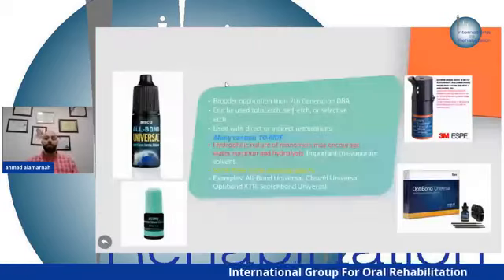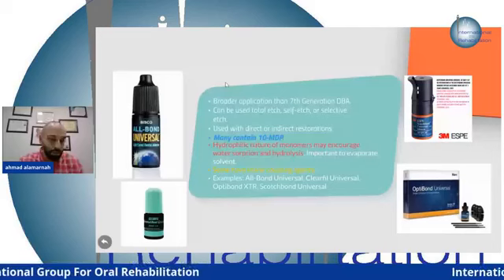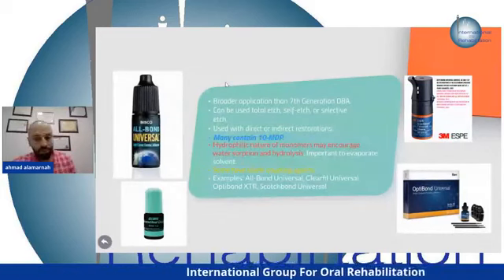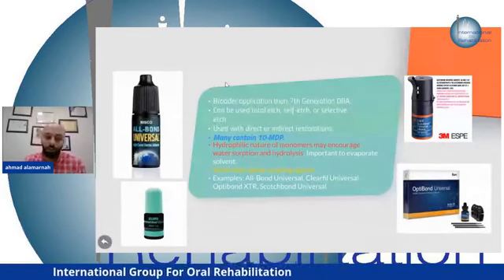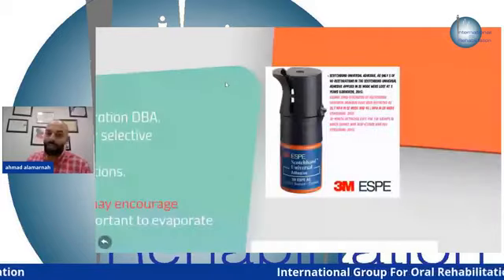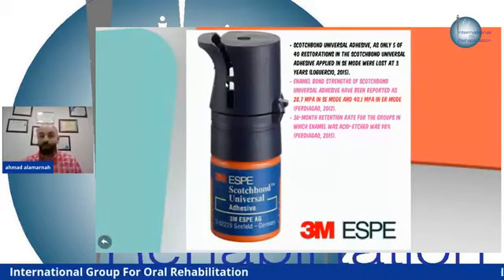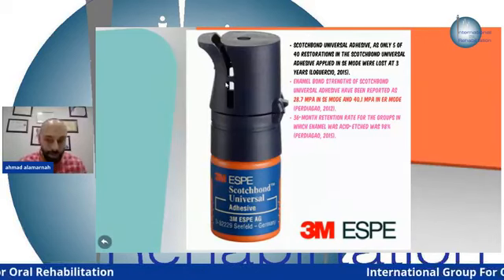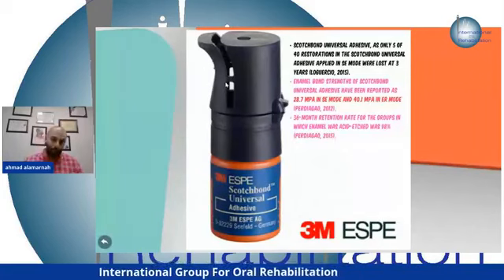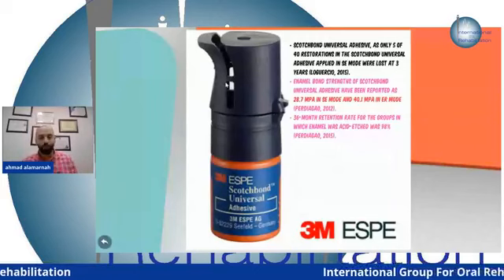And there is the universal. Those are examples of the universal bonding. There's All-Bond Universal from Bisco, Scotchbond Universal from 3M, OptiBond Universal from Kerr, and Clearfil Universal Bond from Kuraray. In the first 3 years, the success rate reaches 98% if you do the etching separately and then the bonding with this type of bonding agent.